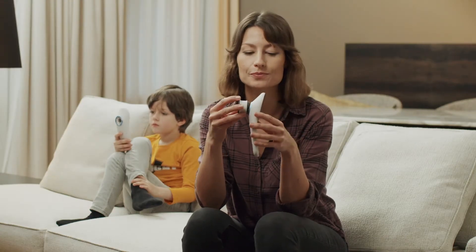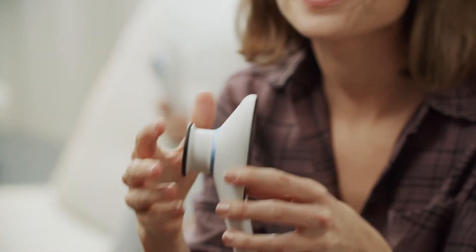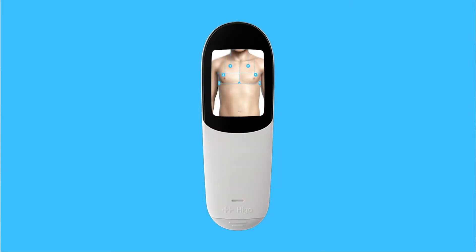Attach the stethoscope module. The lungs are examined in 12 points: 6 on the chest in the front and 6 on the back.